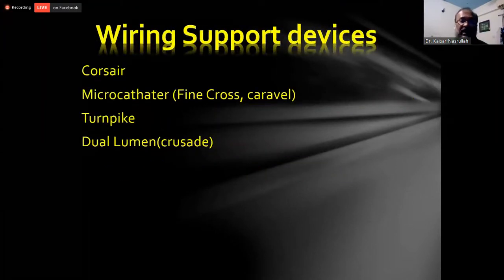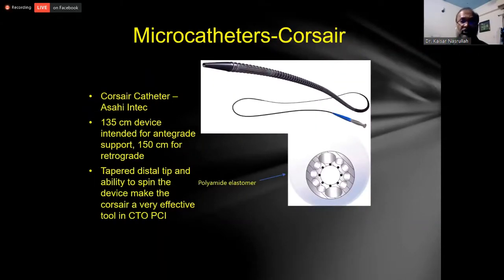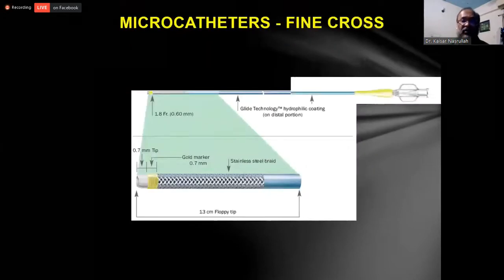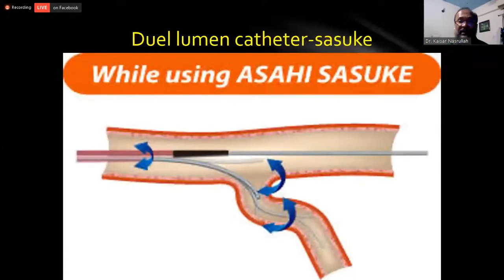The wire supporting devices: Corsair microcatheter, Turnpike, and dual lumen like Crusade. So this is the Corsair microcatheter, also the Channel dilator from Asahi. This is Fine Cross from Terumo. This is Caravel from Asahi. And this is the dual lumen catheter from Asahi, Sasuke.